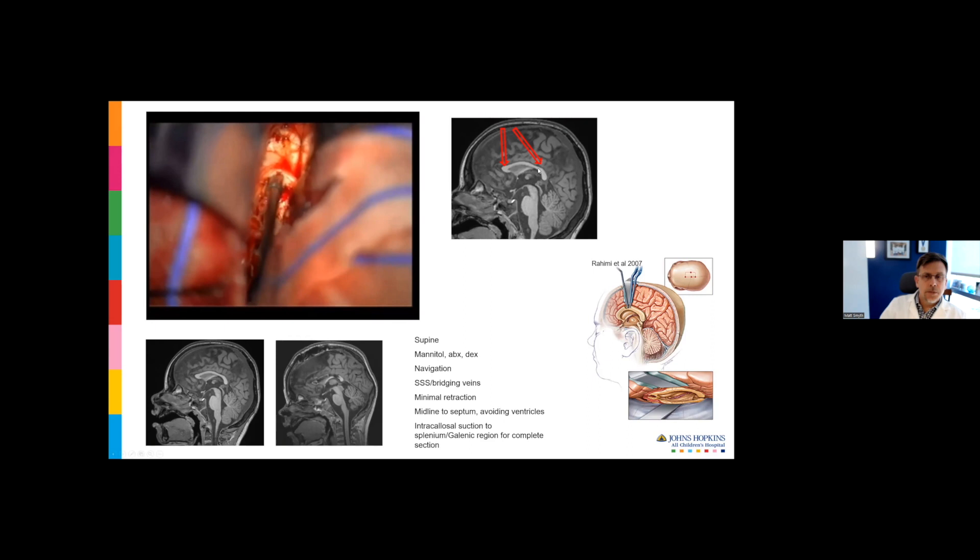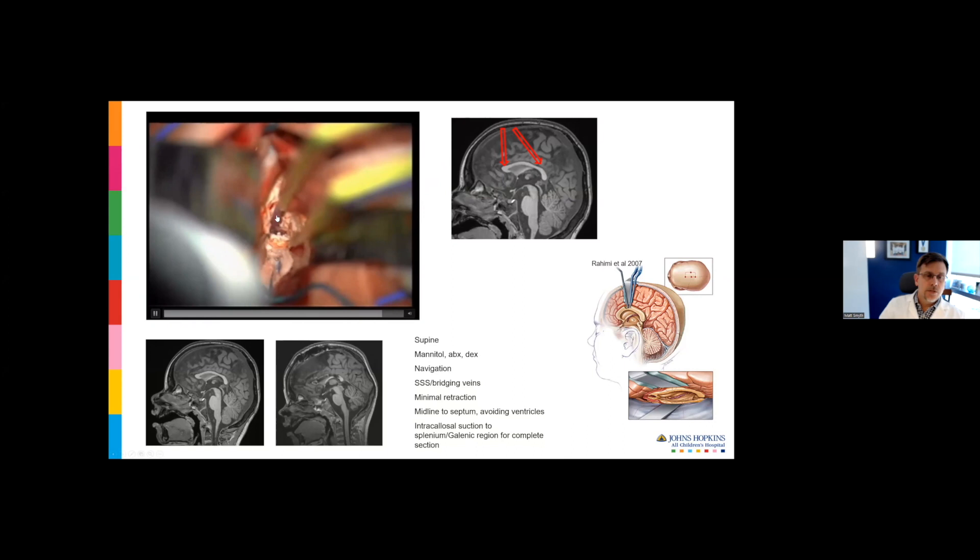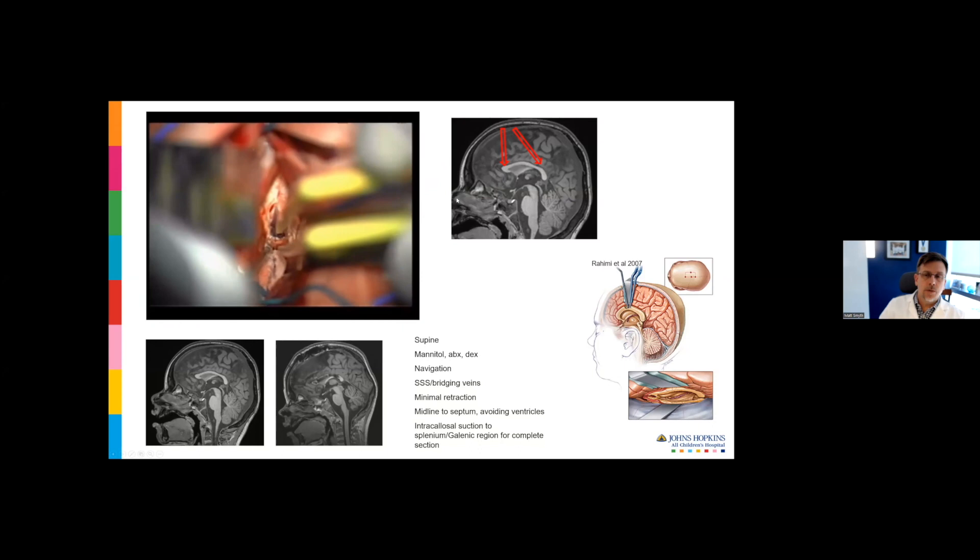I start by cutting the mid-body, and then I orient my scope anteriorly. I'm focusing on the dorsum of the genu right here. I dissect over to the arch of the A2, A3 junction, and then divide those white matter tracts with the bipolar. Here we're coming down to the rostrum, looking down towards the proximal anterior cerebral arteries. Once that front part is disconnected, I drop the head of the bed and orient the scope posteriorly.